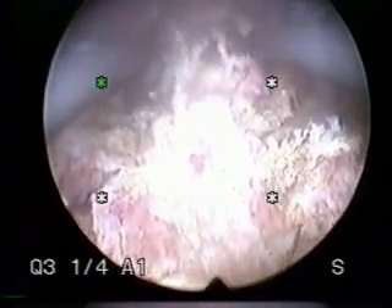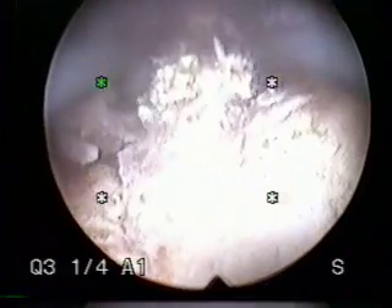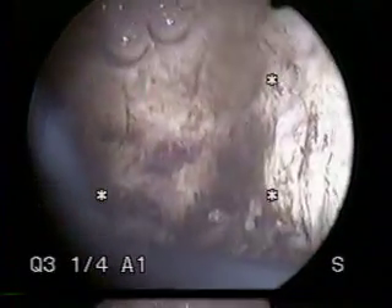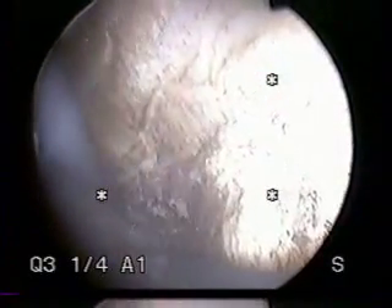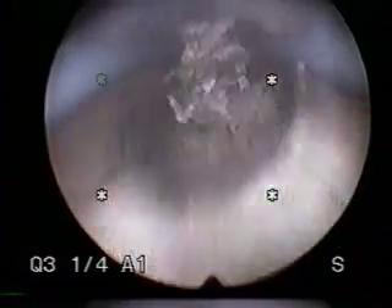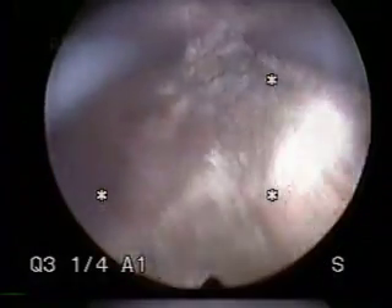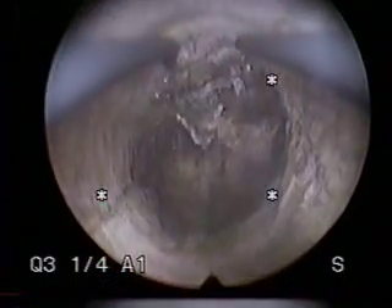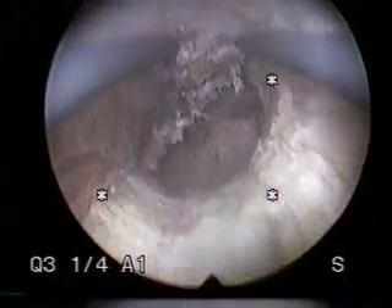And endometrial ablation of the uterine cavity. I'm on the anterior surface of the uterus now, basically on the ceiling, and you can see the entire endometrial cavity looks wonderful after removal of the fibroid. This is before, and this is after. This patient will no longer bleed.